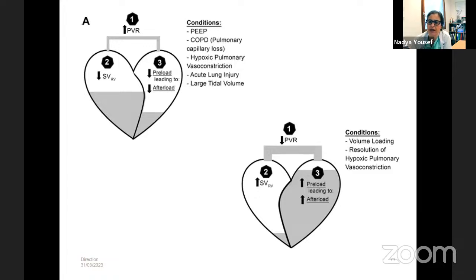And we're starting now to see how that affects, for example, filling pressures, as we would assess, of course, again, using cardiac POCUS and using methods that are not necessarily 100% validated in the newborn, but still give useful information when they're extreme. Like, for example, inferior vena cava volume. If the inferior vena cava is huge, probably this is not where you want to give fluid, or probably you have really high mean airway pressures and you want to go down. Or on the other hand, if you've got very exaggerated respiratory variability on your cardiac output, then probably this can be a sign of low volume, and you could give fluid boluses.